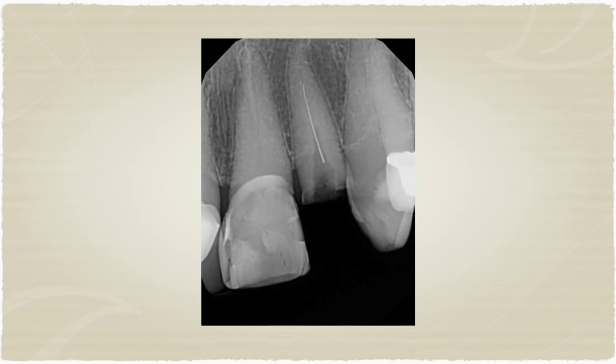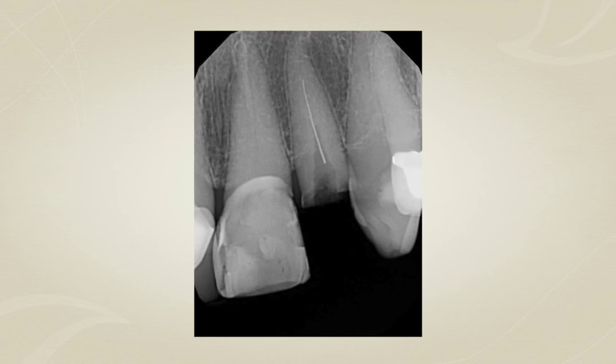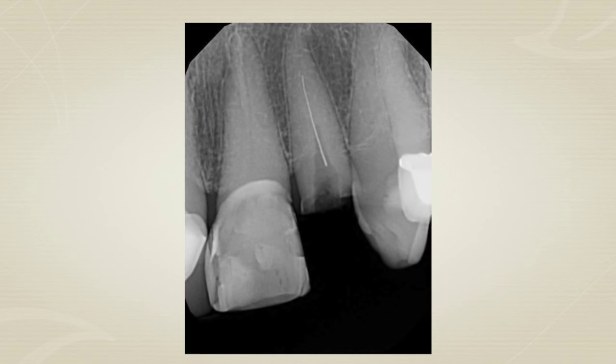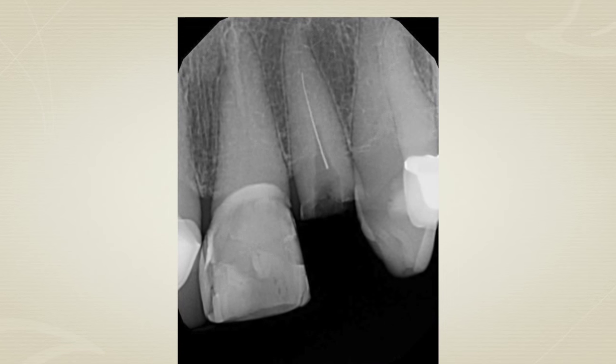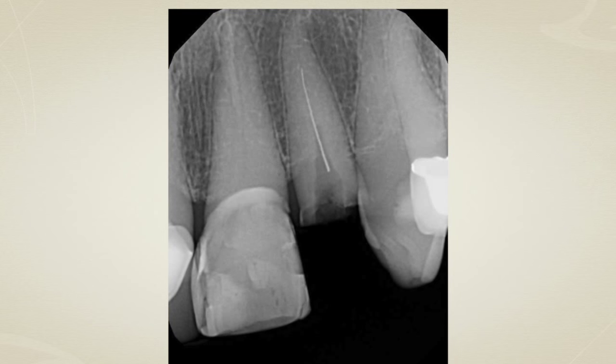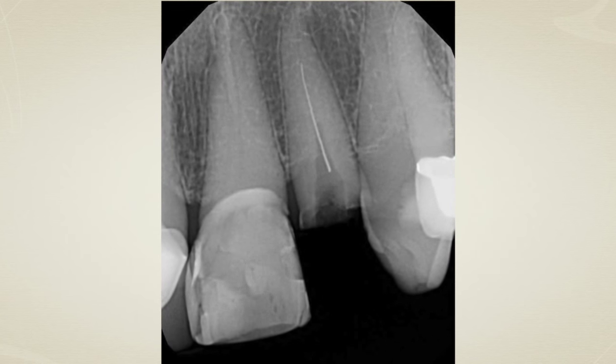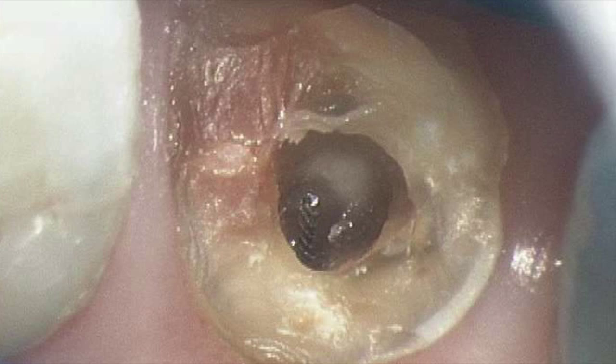That's obviously a very unfortunate situation, and I'm sure anybody out there would very quickly get a rush of cold sweat. You can see here that this file separated — actually a large segment of it separated. Here's the radiograph showing this separation. You can see it's a fairly large segment, but it's just a little bit deep and beyond the area of reach, so I cannot fully grab it with any instrument to remove it. At higher magnification with the microscope, you can actually see it. Generally, when you can see the shaft of an instrument, you can more easily remove it. Visualization is the first rule in determining if a file can be removed.